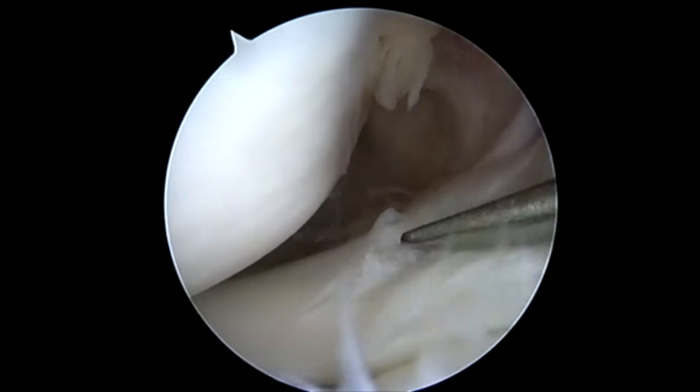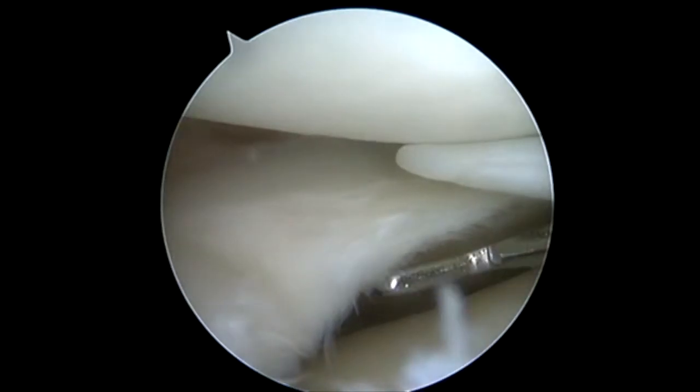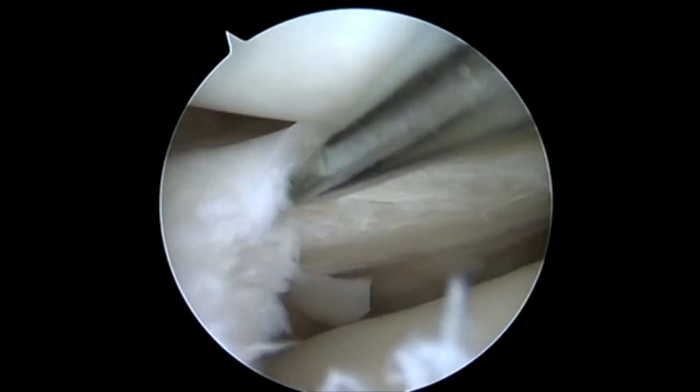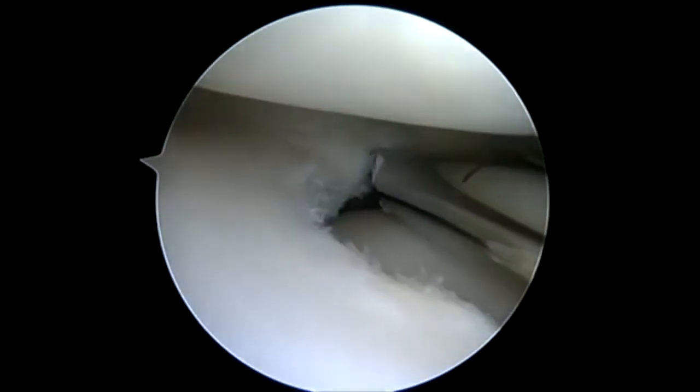Here we're using the NovoStitch Plus device to repair a lateral meniscus. This is a complex tear. We have our posterior horn tear that you've already seen. We also have this horizontal split that's in this middle one-third to anterior horn. This is a location that's very difficult to get to utilizing the NovoStitch Plus device.